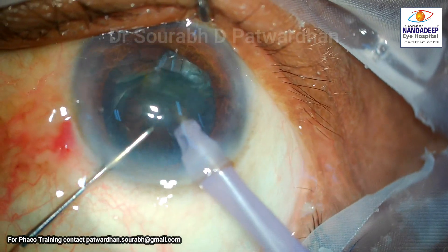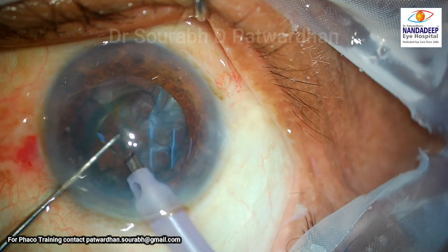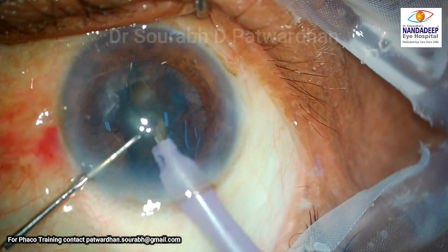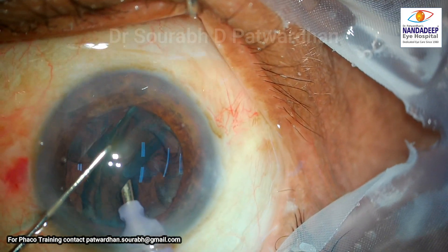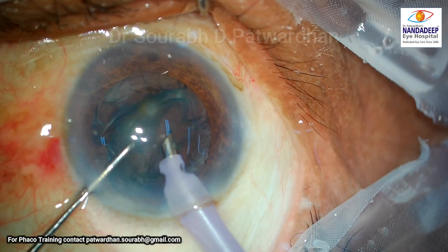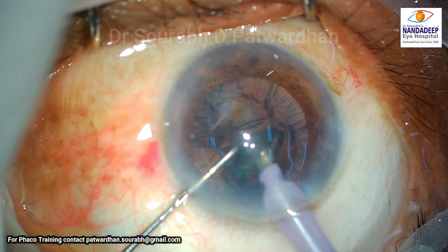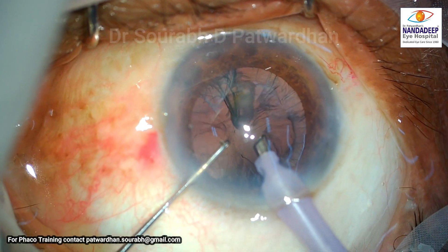For the epi-nucleus, the technique used is the sideways phaco tip to aspirate the anterior part of the epi-nucleus, which came out of the bag. Thanks to the good hydro delineation and hydrodissection done initially, it was an easy maneuver. However, I would prefer the phaco tip to be as central in the safe zone as possible.